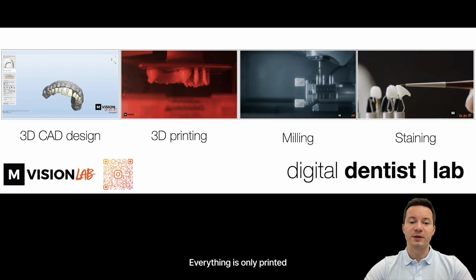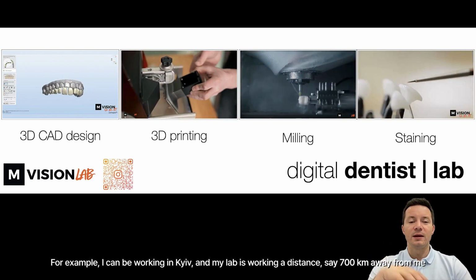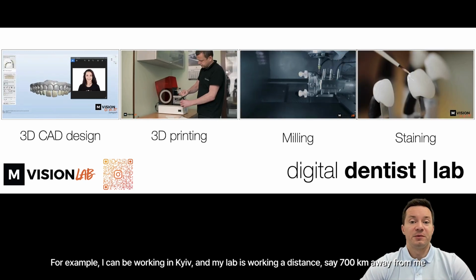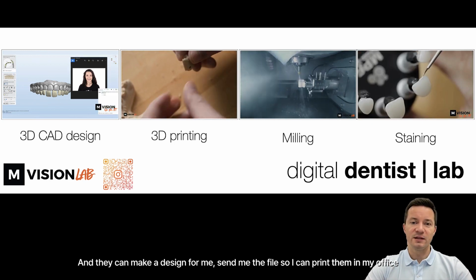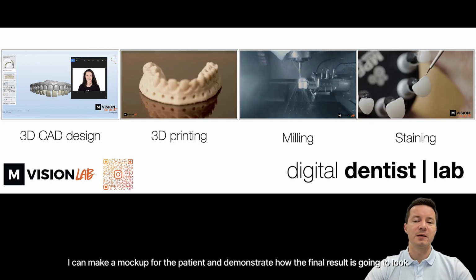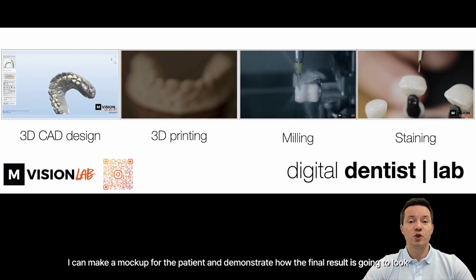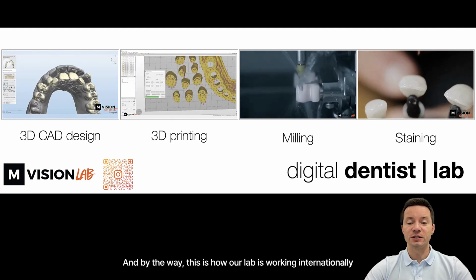Everything is only printed. So for example, I can be working in Kiev and my lab is working 700 kilometers away from me, and they can make a design for me, send me the files, and I can print them in my office. I can make a mock-up for a patient and demonstrate how the final result is going to look. And by the way, this is how our lab is working internationally.